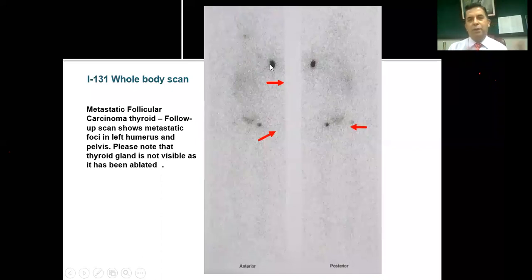Now, to many of you these are just spots, but to a nuclear physician they mean a lot of interesting information. These are just the nuclear medicine imaging. Later on, some structural imaging modalities were added to the nuclear medicine imaging modalities to increase the localization of these tumors. And I'll be talking briefly about them in the coming few slides.